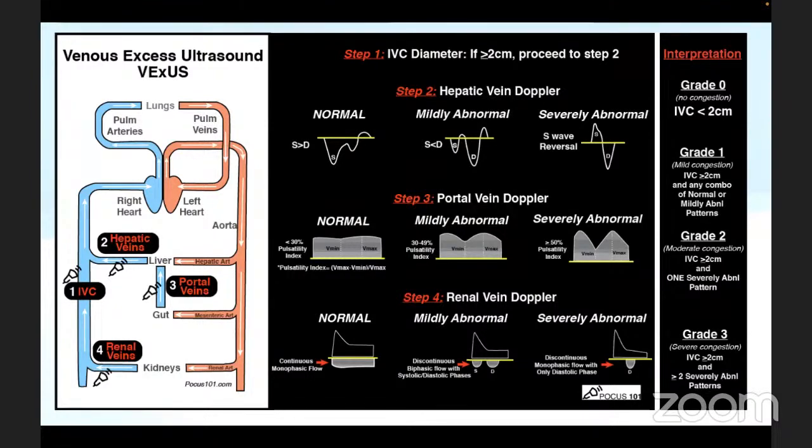If we take the other three apart from IVC, that increases both the sensitivity and specificity of the test. That is why they have added hepatic, portal and renal veins. Maybe, as you said, B lines also help, and are a much better way to quantify organ congestion. And as you said, organ congestion develops in all organs simultaneously, but maybe this is a different modality where you can assess organ perfusion.